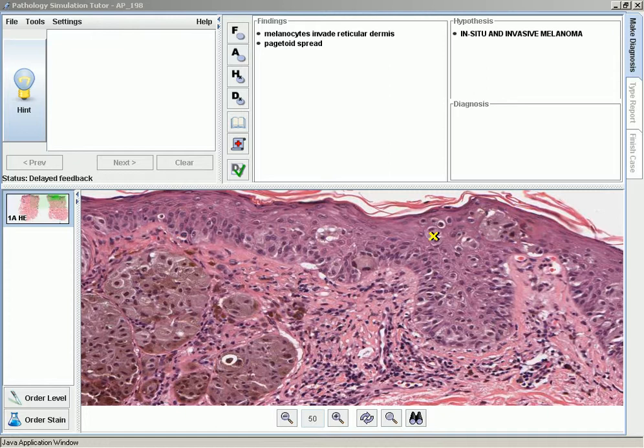While working with the system, you may be asked to locate or confirm the presence or absence of diagnostic criteria and provide differential diagnoses, which should logically lead one to the correct diagnosis. Oftentimes, the most efficient way to complete the case is to ask for hints and go ahead and do what each sequential hint suggests. This strategy will lead you to the correct diagnosis the quickest, so you can move on to the next case while still revealing diagnostic information to you regarding why you may have chosen the incorrect diagnosis initially.